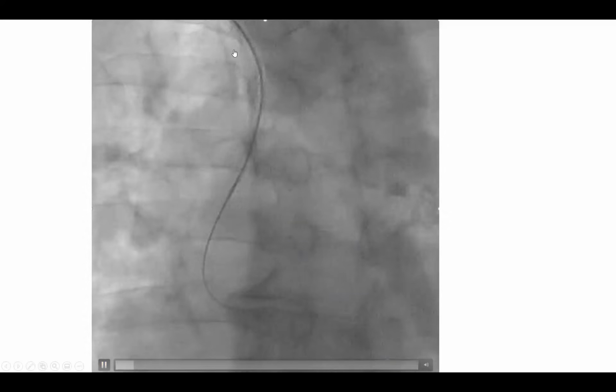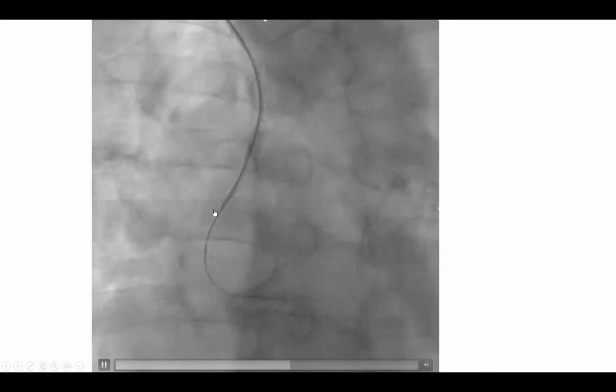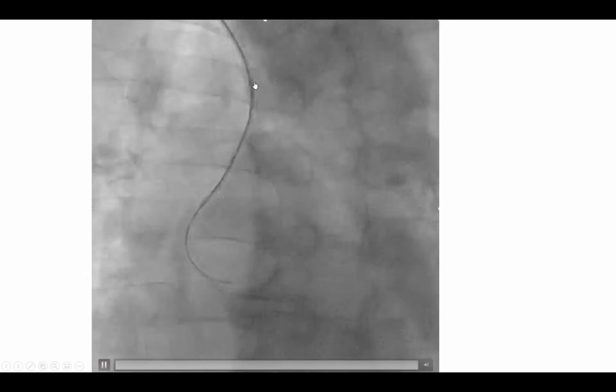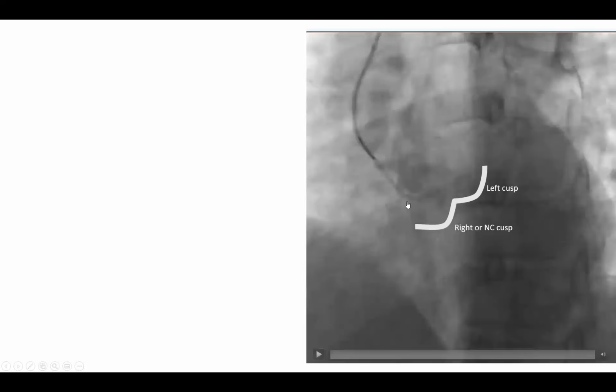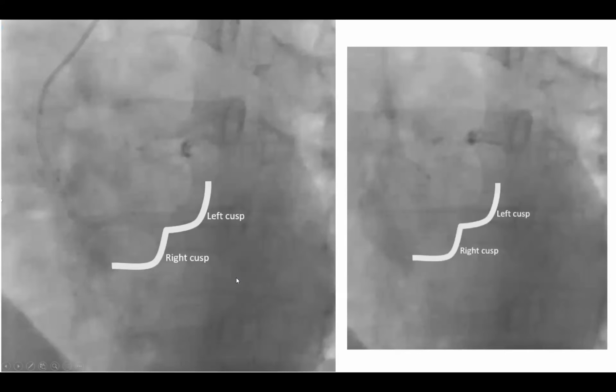And this is another case where you're advancing it and it shows you more. This is a case where you see how the catheter has a propensity to look outward. If you keep pushing it like this, you may prolapse the whole system in the aortic arch. So as you're advancing here, you need to be clockwise torquing, and again, maybe a deep breath as in the prior slide to make it look toward the left side like this.